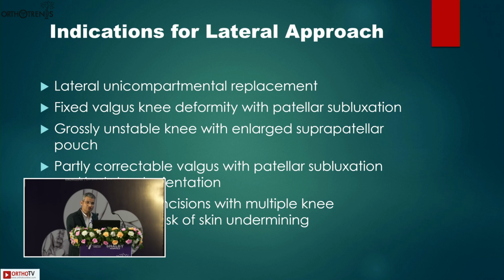So what are the indications of a lateral approach? Lateral unicompartmental replacement, fixed valgus knee deformity with patellar subluxation, grossly unstable knee with enlarged suprapatellar pouch, partially correctable valgus with patellar subluxation, and previous lateral incision with multiple knee operations and risk of skin undermining.